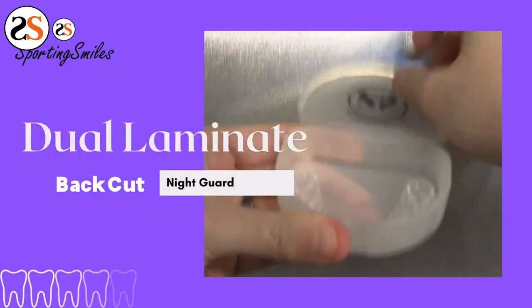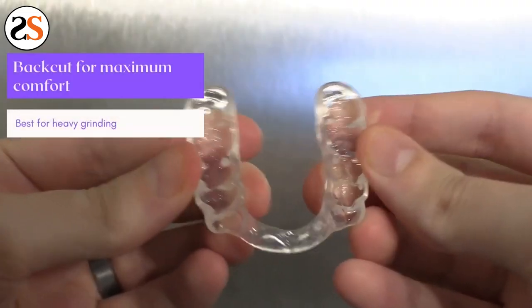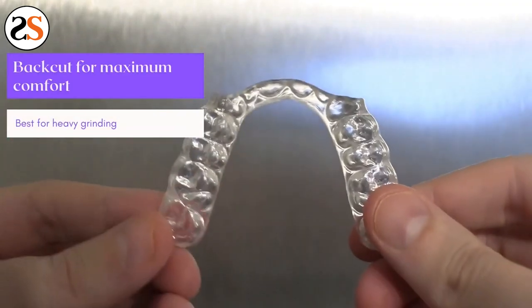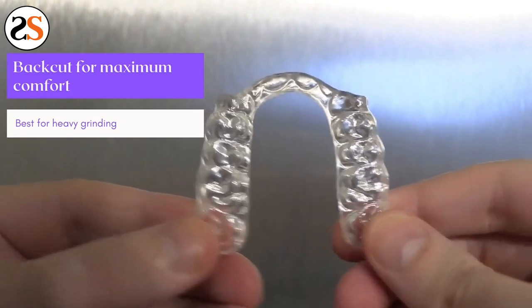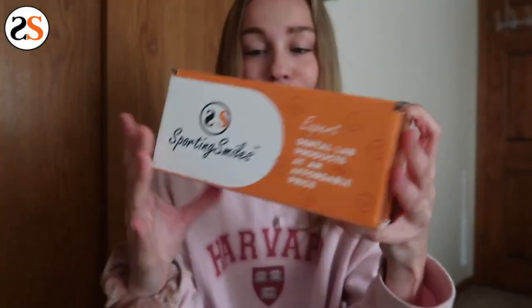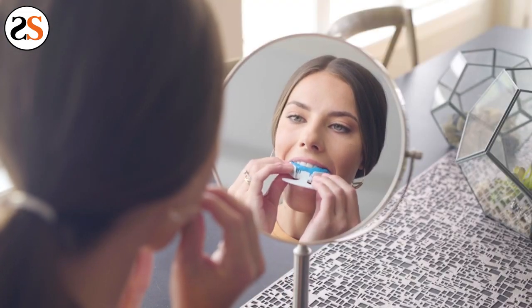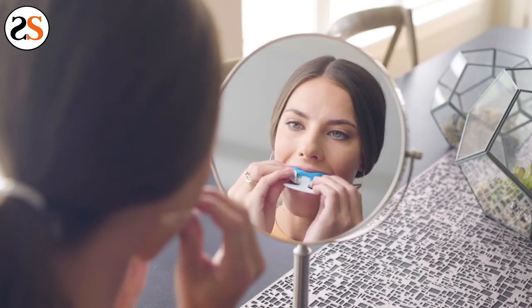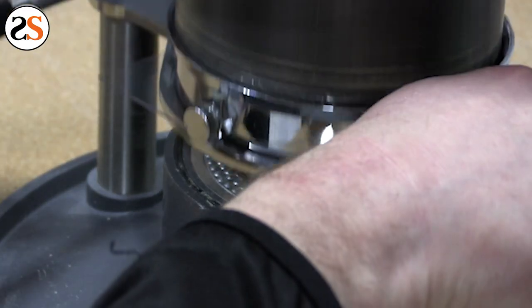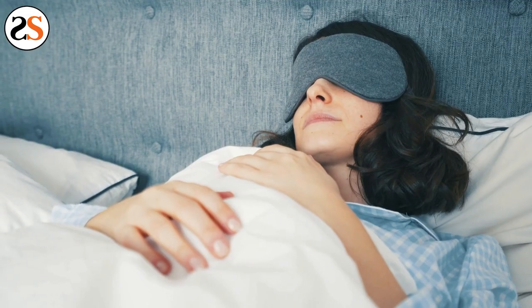A great option to receive a custom night guard for half the cost of the dentist is from Sporting Smiles. It's the exact night guard you would receive from the dentist, but at a fraction of the cost. Sporting Smiles will send you their patented impression kit, and with easy video and written instructions, you take your impressions before sending them back with free three-way shipping. Once Sporting Smiles receives your impression, they'll craft you a night guard for TMJ.